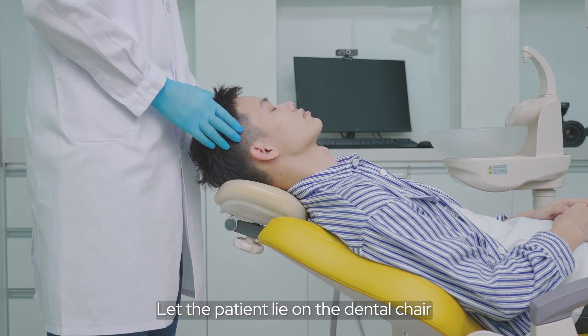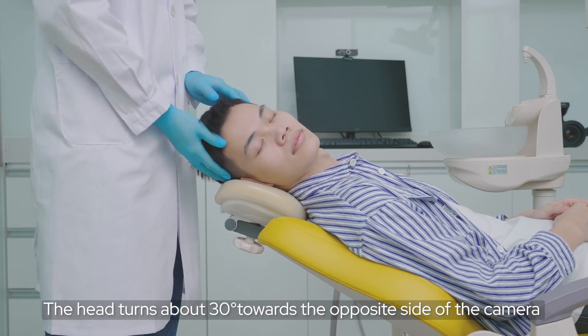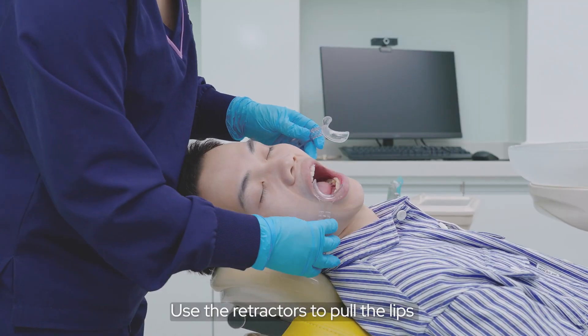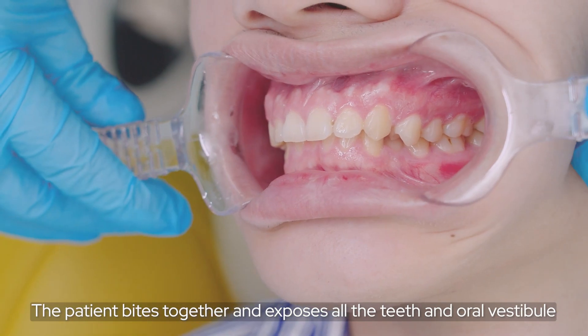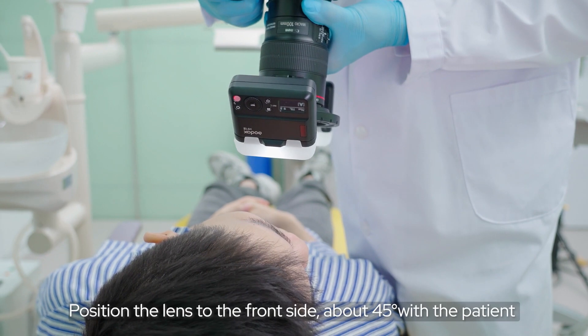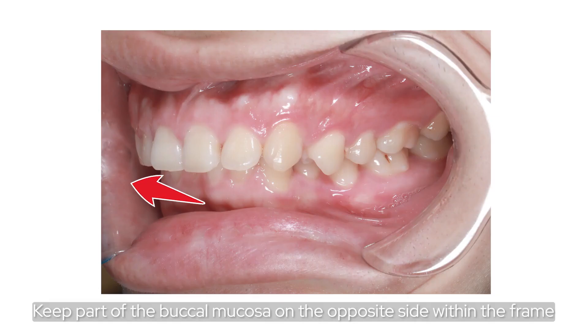Let the patient lie on the dental chair. The head turns about 30 degrees towards the opposite side of the camera. Use the retractor to pull the lips. The patient bites together and exposes all the teeth and oral vestibule. Position the lens to the front side, about 45 degrees with the patient. Keep part of the buccal mucosa on the opposite side within the frame.